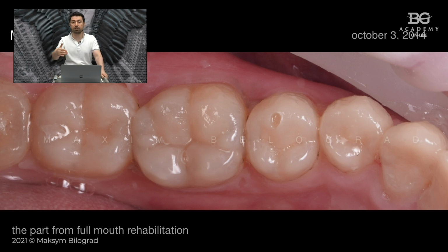There are many different types and strategies to transfer that kind of mock-up into the patient's mouth, so adhesive mock-ups, injectable mock-ups, printed or milled mock-ups, etc. So we can check our position, we can check the bite of our patient. In this case, we raised the vertical dimension of occlusion. So definitely we would like to understand if the jaw position is correct and the bite is correct.